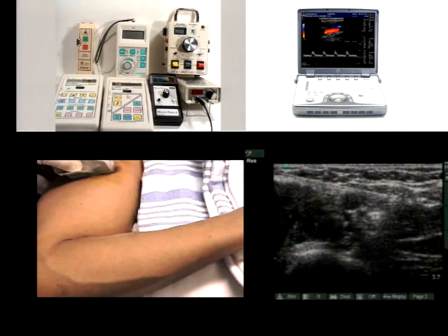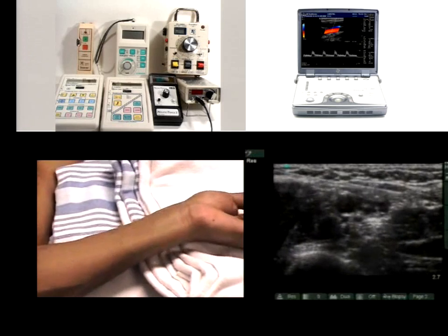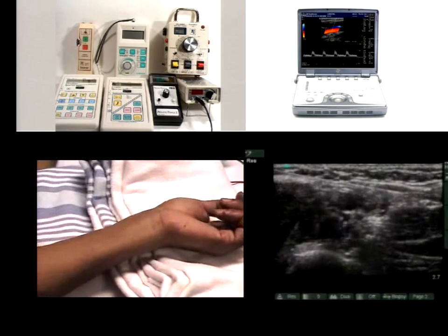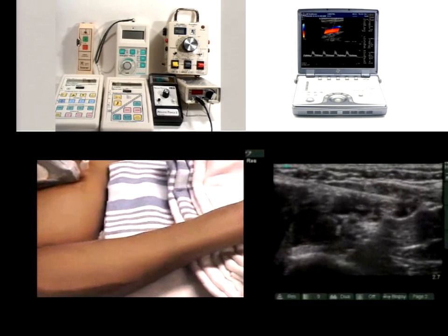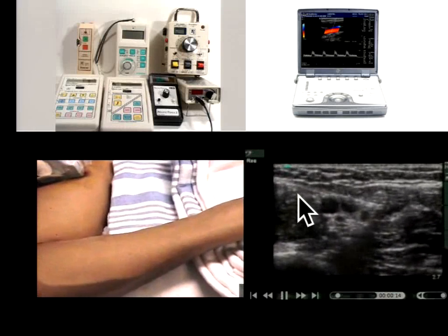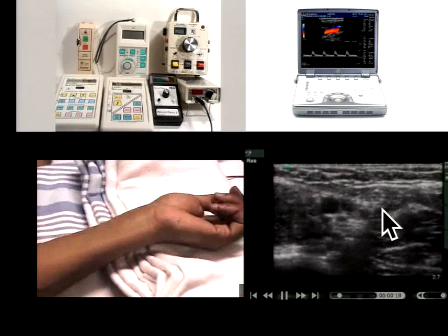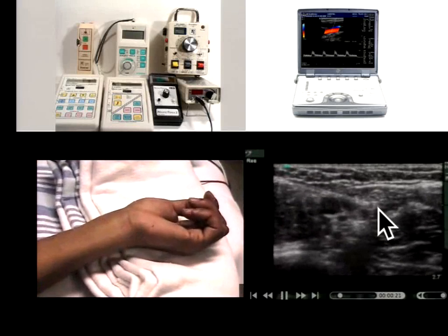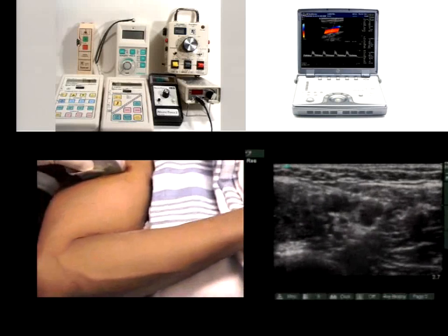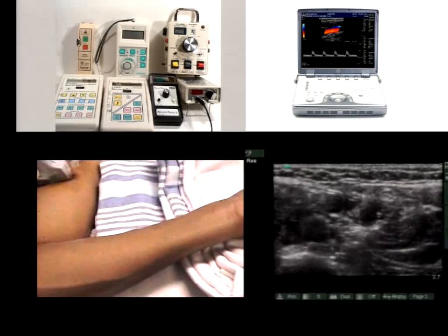Ben has already talked to you about nerve stimulation, the old days we used it, and the endpoint is where the needle tip is, and we will seek a certain endpoint for motor response. For ultrasound now, we certainly can see the needle. When the needle is placed superficially, we can see where the needle tip is in relationship to the nerve, and also we can see the local anesthetic spread. But what we really don't know at this time is what is the optimal local anesthetic spread.